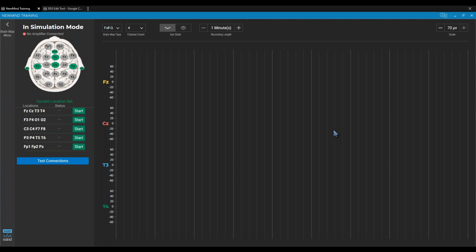So if during that minute of testing, I saw half of the time I was getting a clean signal and the other half of the time it was artifact, I'm probably going to do maybe 3 minutes and keep my fingers crossed that that's enough and that I don't have to remap this kid in a week. If I'm seeing that 60, 70% of the time it's artifact and the rest is clean signal, I'm going to have to go to 4 or 5 minutes. It's going to be a long recording, but that's the only way I'm going to acquire that map.